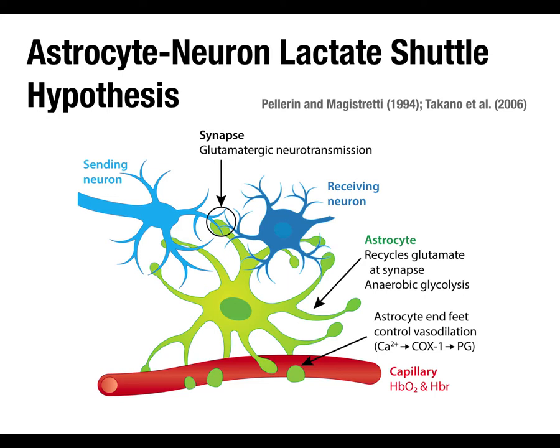More or less? Okay. So that's the chemical process, and I think the really important thing to take away from that, besides the fact that the BOLD signal reflects this gross increase in oxygen in activated brain areas, is how indirect the relationship is between changes in neural activity and changes in the fMRI signal that we ultimately measure, right? Because a neuron fires more, sends more glutamate out.